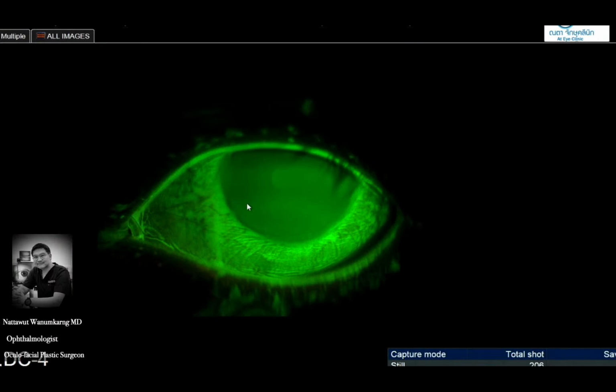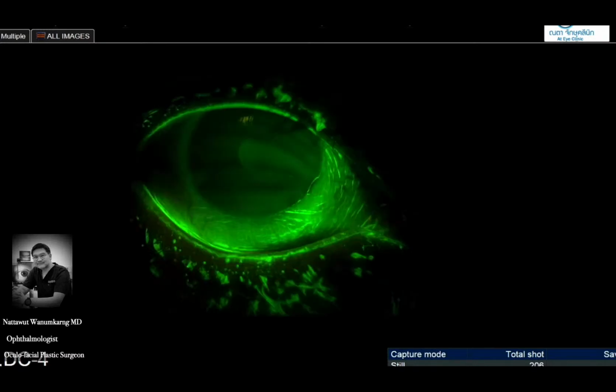In some cases, the cornea may touch the tube. They have keratitis and punctate keratopathy on the inner aspect of the cornea. The patient may feel some itching and feel uncomfortable. This is on the right side, that's the normal side.